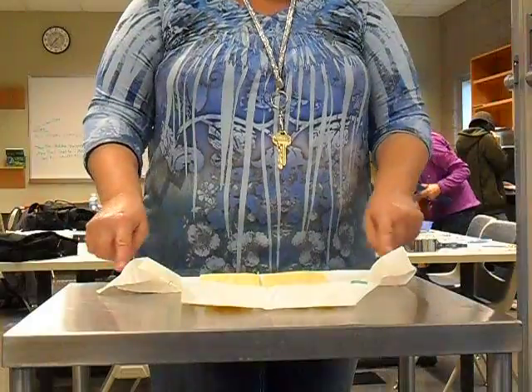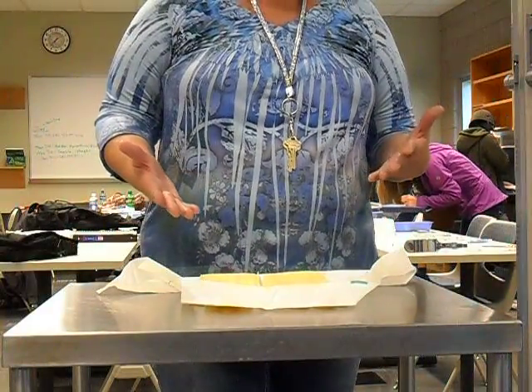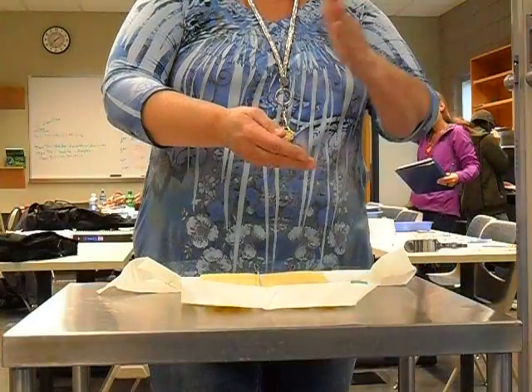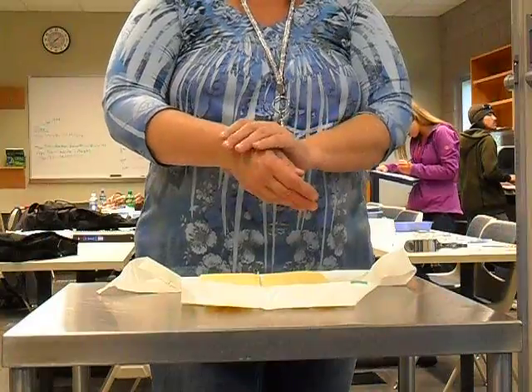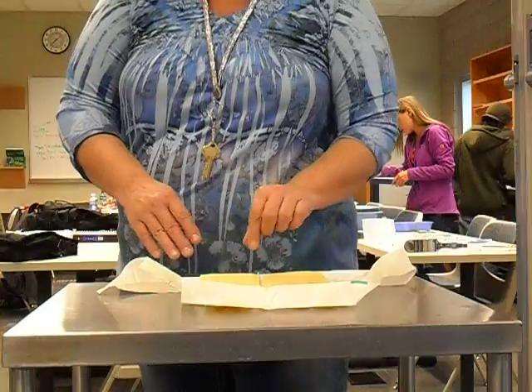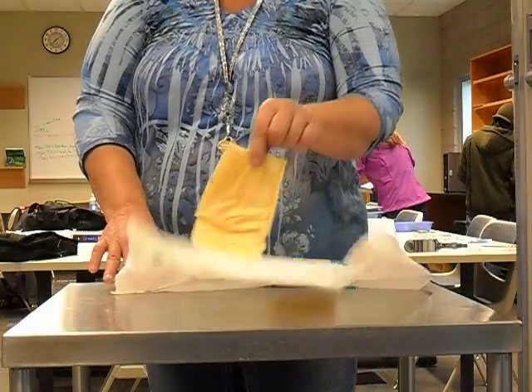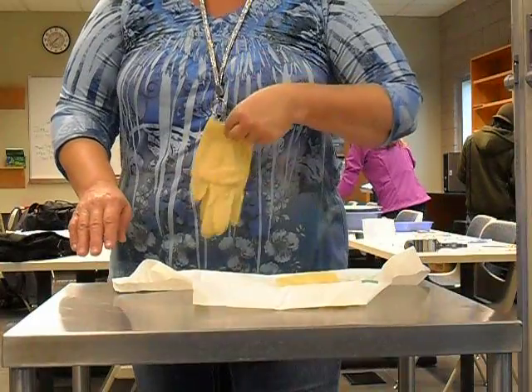Now you have to remember where you've been, because now you're going to choose a glove to pick up. And I like to pick up my right first. And the gloves are folded with a cuff, so half of the glove is going to be inside out. It's going to invert onto your hand, and it's going to become contaminated, the inside anyway. So we can choose to pick up the left or the right, so I will pick up the right from the edge of the cuff. Now, when I pick this up, I have to be very careful that I don't drag it along here, I don't touch the metal, I don't touch myself.